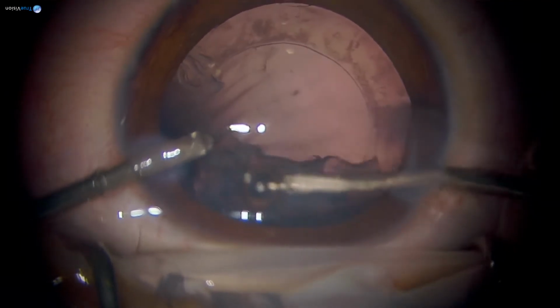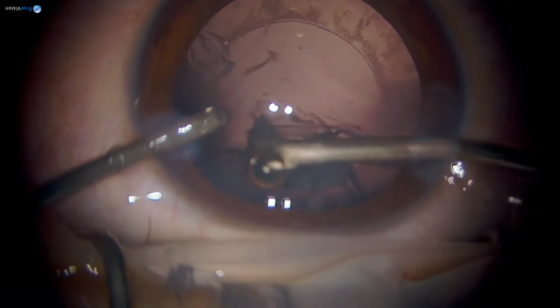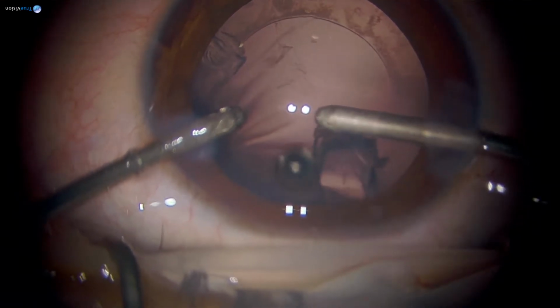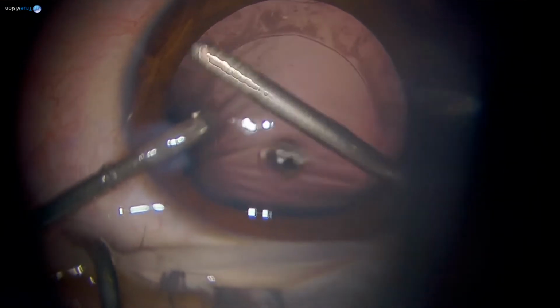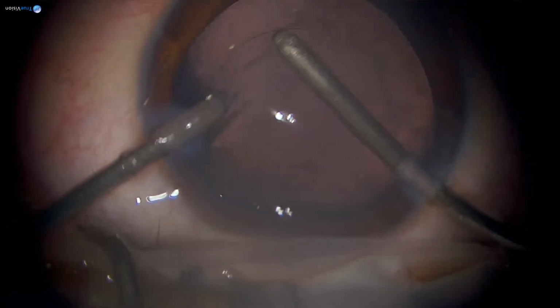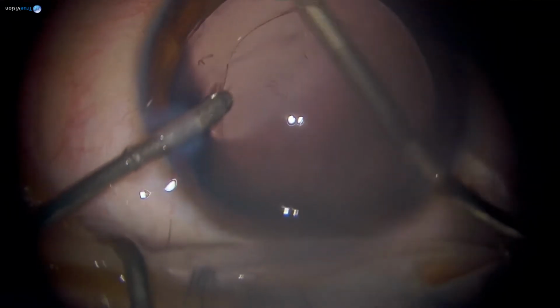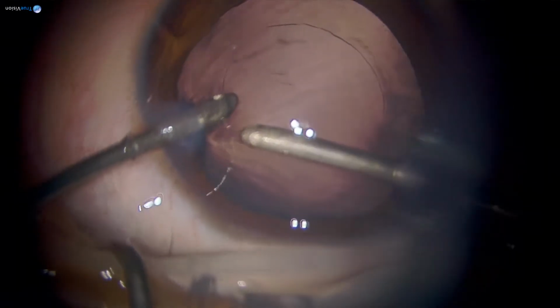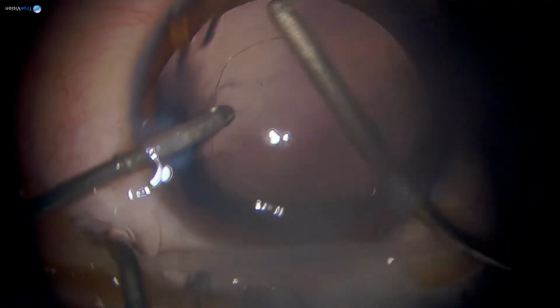And sir, I know every patient is different, but back home in your practice, at what age do you do a primary posterior capsulotomy with vitrectomy, or are able to get them to do a YAG capsulotomy? Typical textbook says we should not do primary posterior capsulotomy after 6 years of age. What we have seen in our country is even after 8 years, 9 years, they develop this capsular opacity. So I do it till 8 years of age or so. Is it just the posterior capsule that's opacifying, or is it also the anterior hyaloid? It's even the anterior hyaloid. We did a study doing just PPC as well as without anterior vitrectomy. Still, we had opacification in these kids. So I think it's a combination of both. The cells migrate from the vitreous. It acts as a scaffold and it comes.